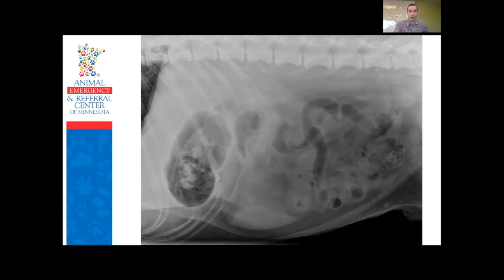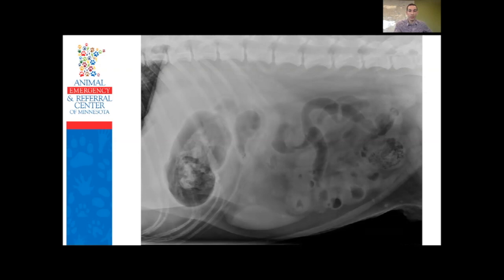Serosal detail near the stomach isn't great — it's also a big dog, so that's limiting. There appears to be streaky cloth-like foreign material in the ventral abdomen. Colon looks a bit empty but I couldn't follow it to the pelvic inlet in this image — that's exactly why we like to include the femoral joint area. Overall, this is high-confidence anchored linear foreign body causing outflow obstruction.